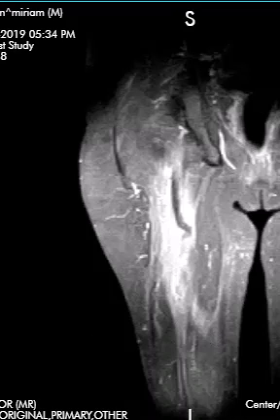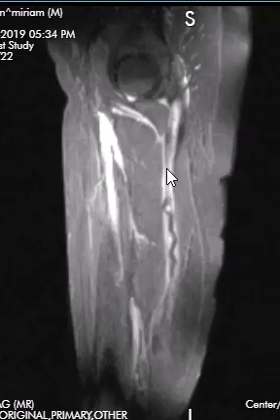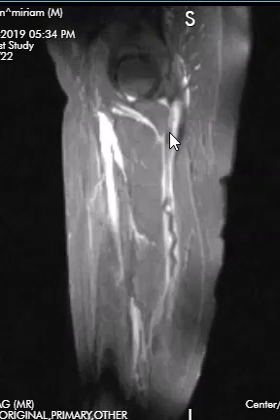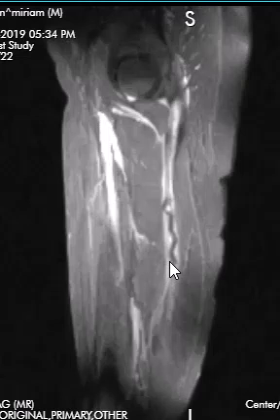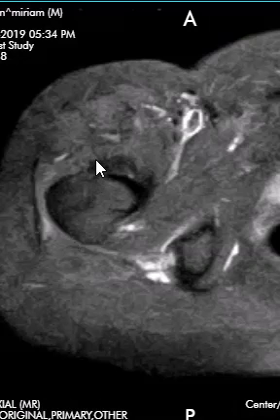So we're going to look in a sagittal view here, look at it from another angle. Here we can see the recoiled tendon. Here's the proximal portion, here's recoiled coming down, and now we're going to look at the origin on the ischial tuberosity to make totally sure we got the right one.